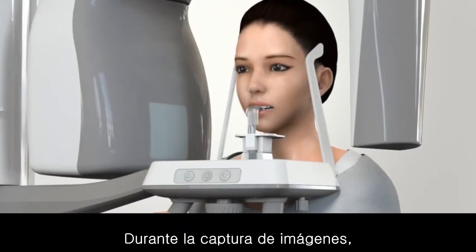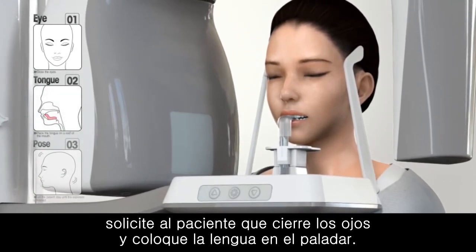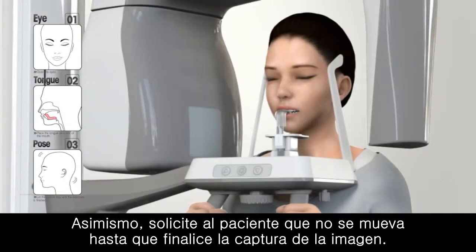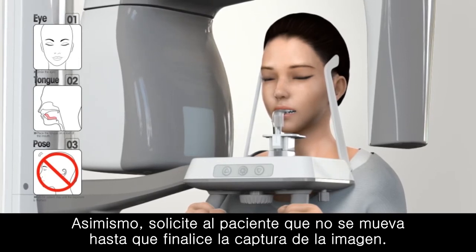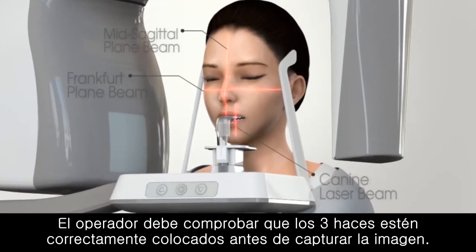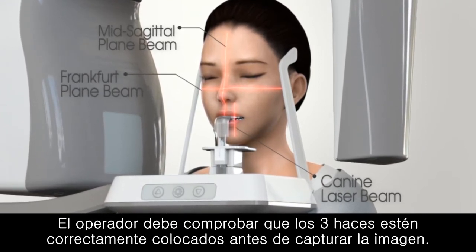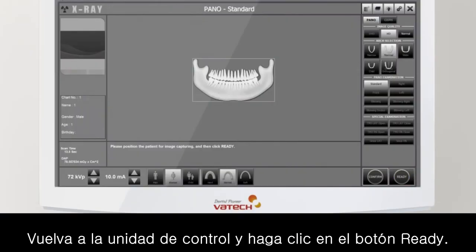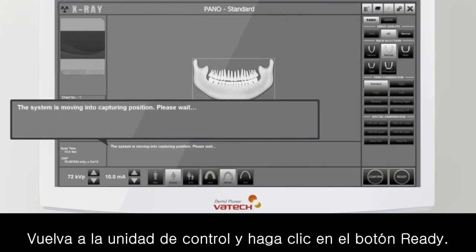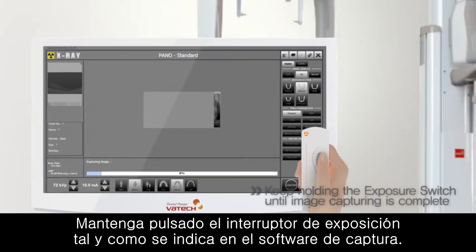During image capturing, ask the patient to close the eyes and place the tongue to the hard palate. Also, instruct the patient not to move until the image capturing is completed. The operator should confirm 3 beams are placed appropriately before capturing the image. Back at the control unit, click the Ready button. Press and hold the exposure switch as guided in the capture software.